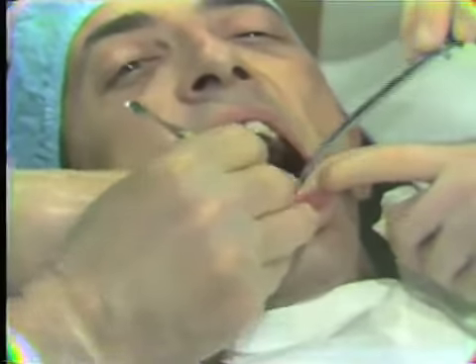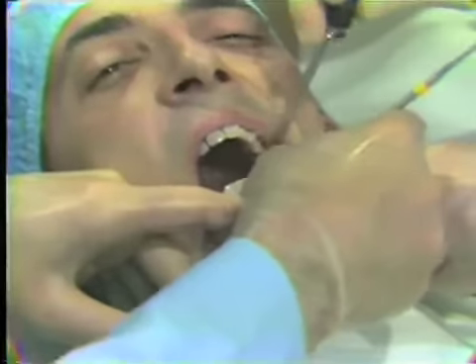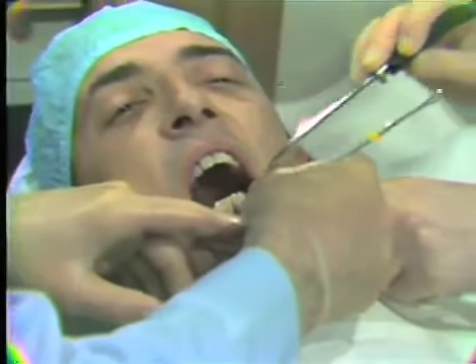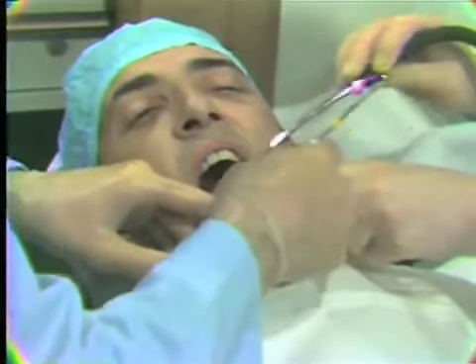At the same time she's aspirating in the surgical site, she will also periodically move in the area underneath the tongue and in the posterior part of the mouth so that we can clean the accumulation of saliva and hemorrhage from that area of the mouth.